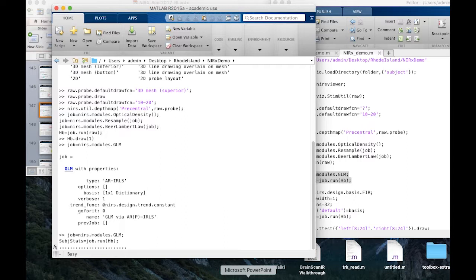So what I'm running right now is my module called GLM. To reduce the noise, you have some NIRS probes in there, and then you use those NIRS probes. This data doesn't have near distances. This was basically what we collected yesterday with Thomas: 3 centimeter source detector distances on the left and right motor cortex, no short distances.